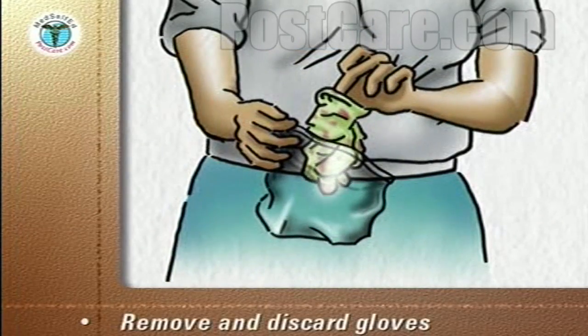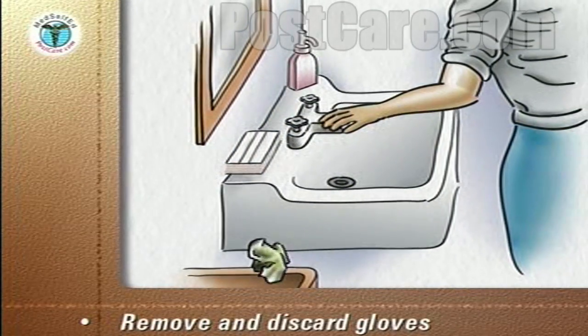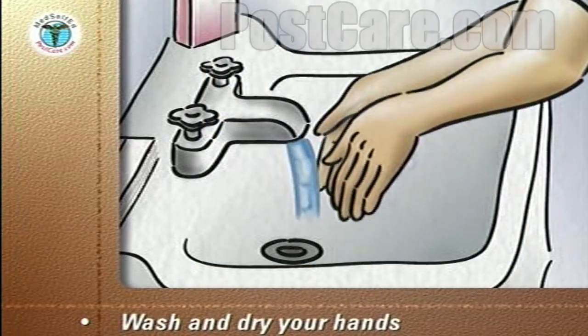Remove your gloves and discard them into the plastic storage bag. Seal the bag and put it into the trash. Wash and dry your hands, and discard the paper towel into the trash.